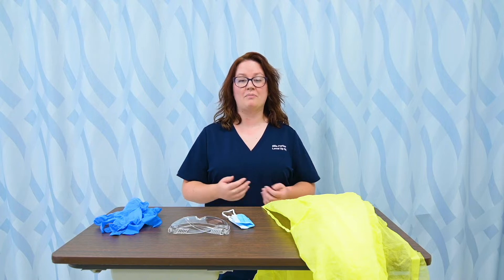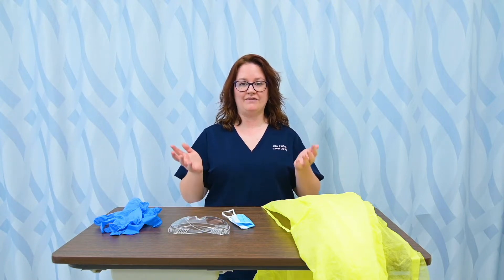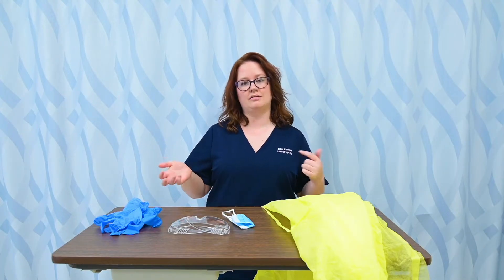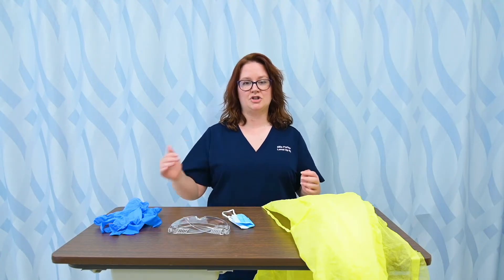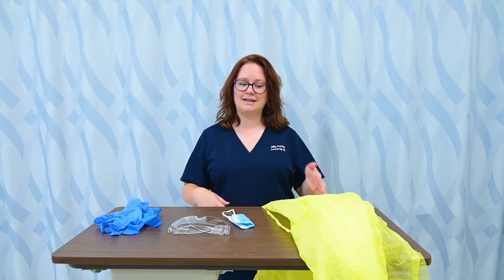Before I can apply PPE or personal protective equipment, I need to have already done hand hygiene, so I've done that. PPE always goes on in the same order. You may or may not use certain parts of it depending on what type of precaution your patient is on, but I'm going to demonstrate the full order in case we were using all parts today. So we start with the gown.